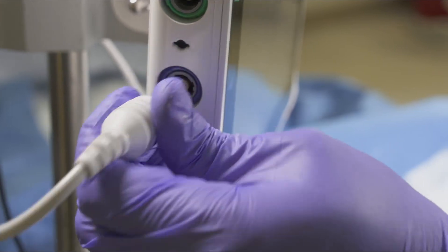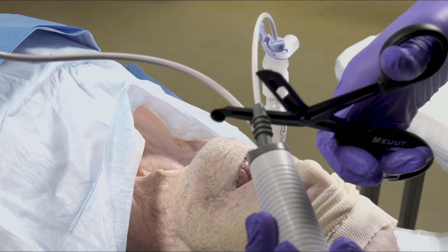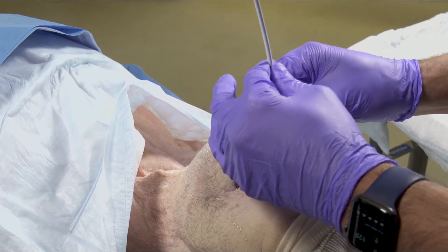Disconnect the scope from the video screen, which is its power source. Then cut the scope with trauma shears just distal to the rubber ET tube holder. Secure the scope, which now functions like a bougie.